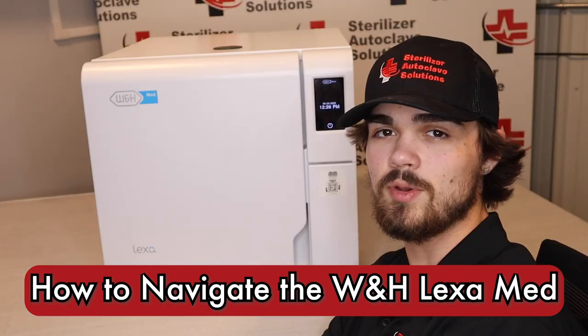Hi, this is Jacob with Sterilizer Autoclave Solutions, and today we're going to be discussing how to navigate the interface of the W&H Lexa Med.